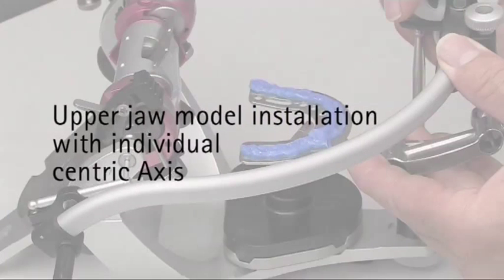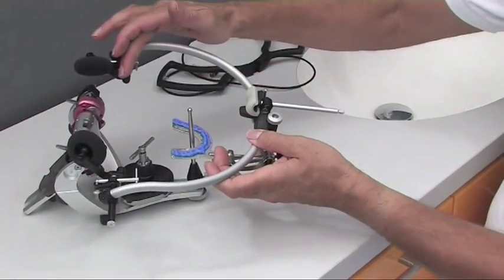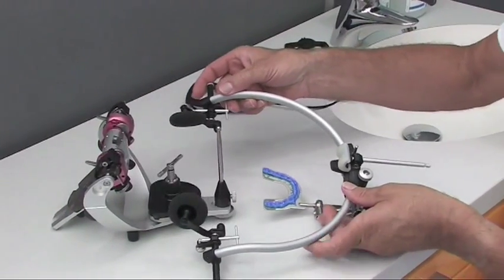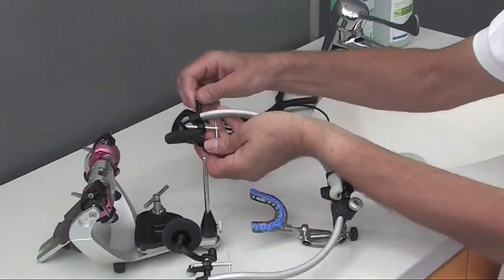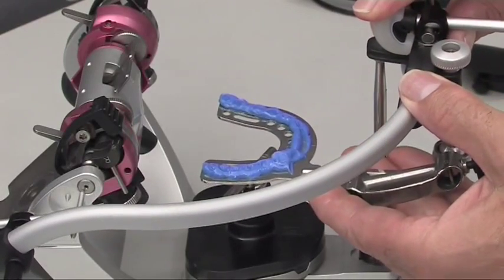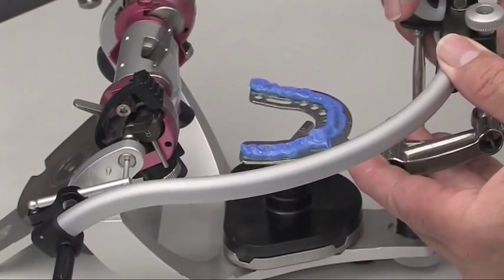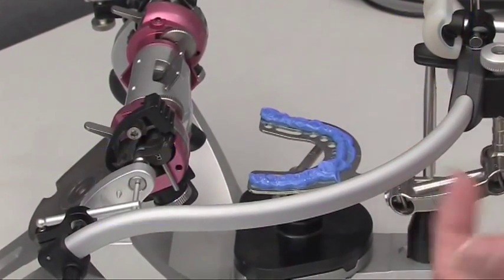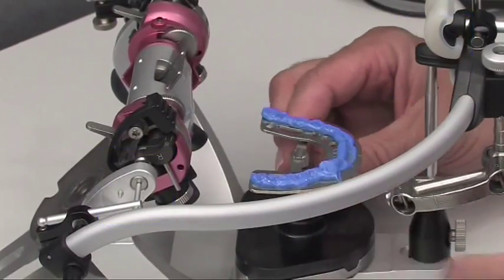Upper jaw model installation with individual centric axis. The face bow can now be aligned with the axis pointers to the articulator's axis. The bow is closed by using the knurled screw and placed on the incisal pin.